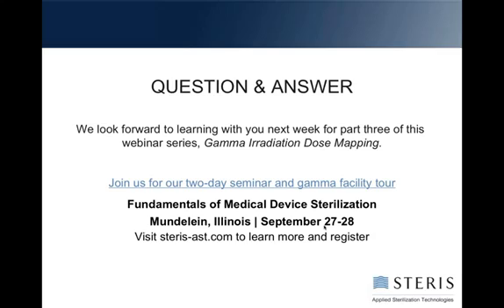And water supplies can be tremendously variable within a day, so that things you made early in the day could be different than ones later in the day, so you take random samples. It's a limited number of samples you're required to test based on the batch size, so it would never be more than 10 samples, and it could be as low as 3. But it is not related to the dose audit at all. It is a separate test unrelated to dose setting.